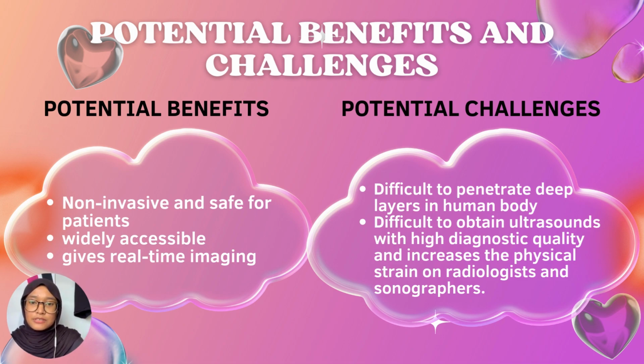Unfortunately, ultrasound also has some challenges. The first challenge is that ultrasound is difficult to penetrate deep layers in the human body. This is because ultrasound uses low-energy sound waves, which do not travel well through bone or air. It is difficult to use ultrasound for imaging the brain, lungs, or deep structures for obese patients.